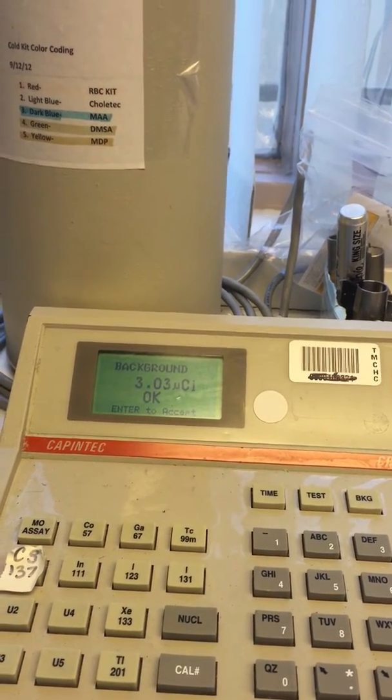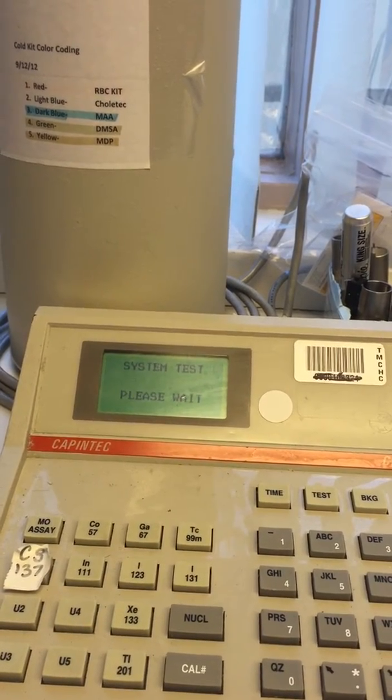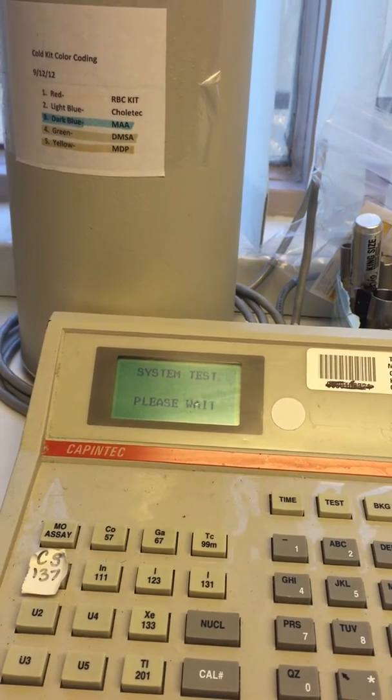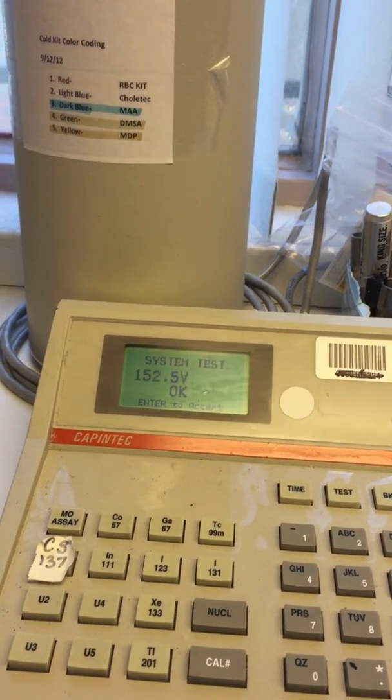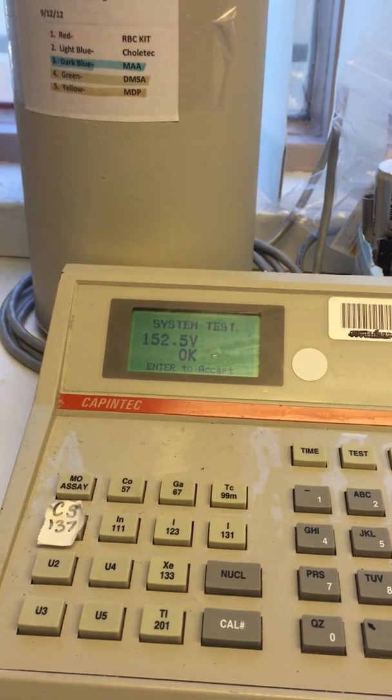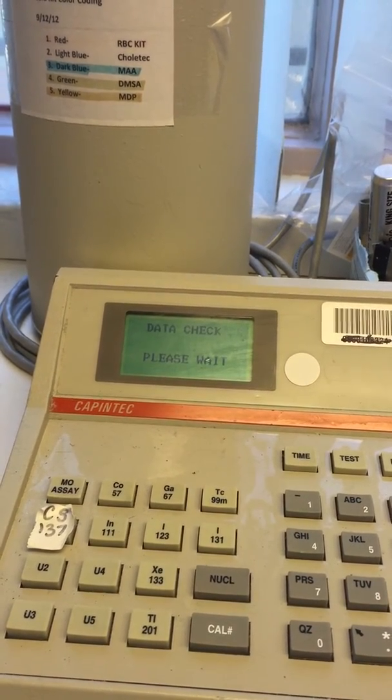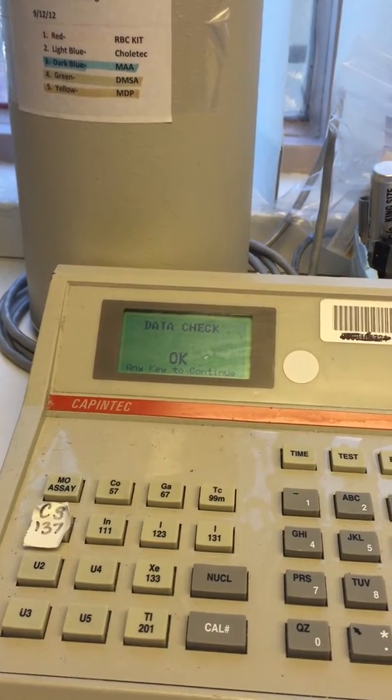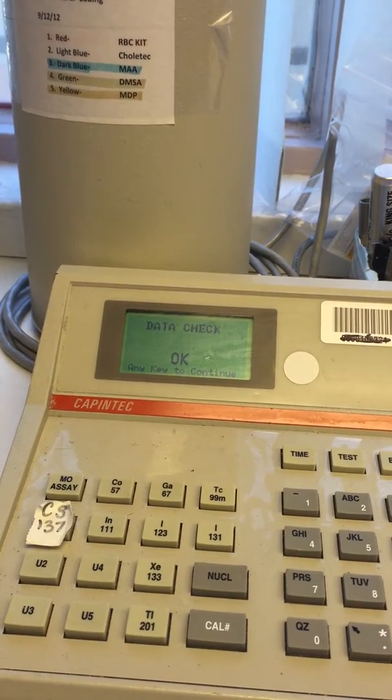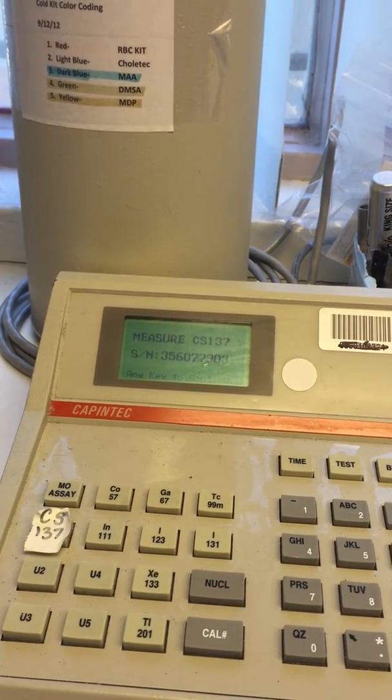Okay, we're going to push enter. Set that. Then it's going to measure the voltage of the dose calibrator. 152.5. That's good. Any key? Okay.